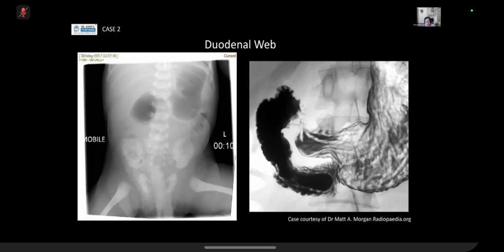I mean, there are people who say that if you really struggle to see the DJ flexure and you just want nicer pictures, but you know that it's a normal, not a malrotated study, after your water soluble contrast, you can give barium. But that's what people say when you hear people talk about it. I don't do it, and I think Toby probably doesn't either. The name is Omnipaque.